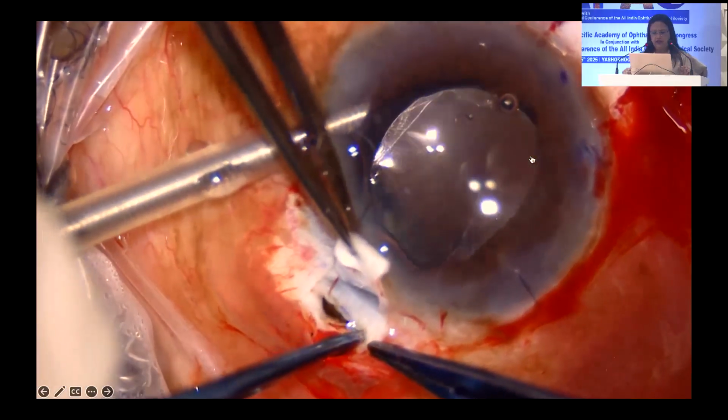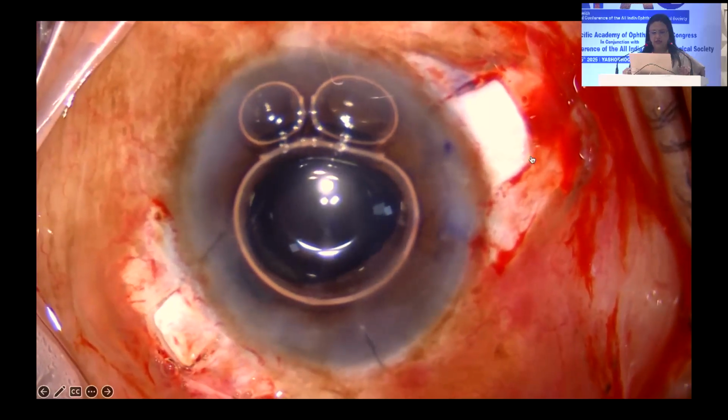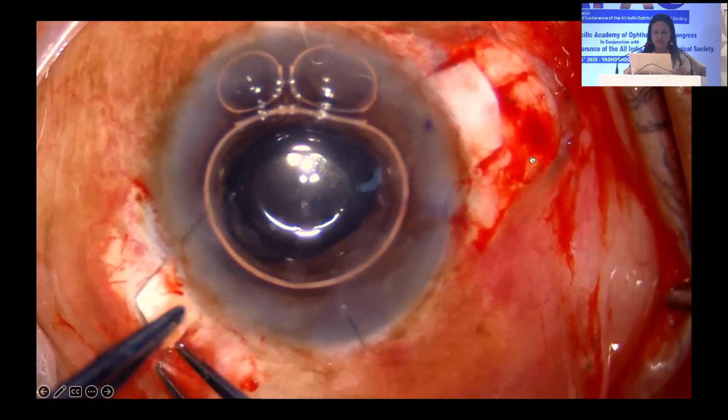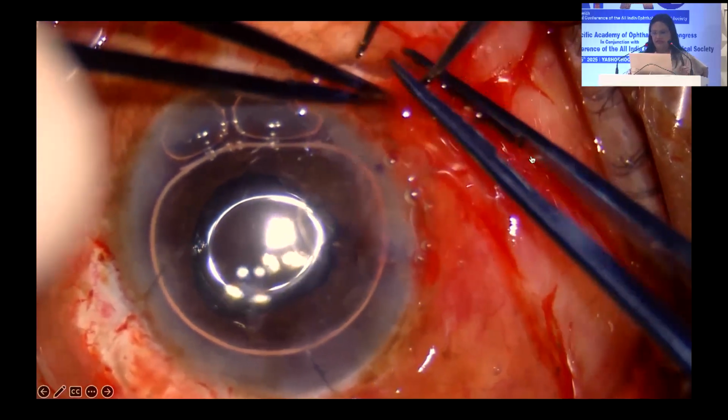A little bit of iris prolapse, actually you really don't have to worry about. You can always tuck it back in, and you're going to glue the flap anyway. And the glue is applied, and the procedure is completed. And the patient again has a follow-up of about 7-8 years.